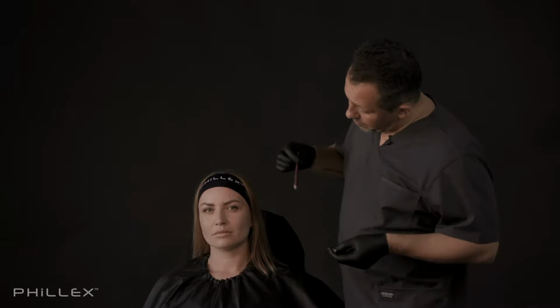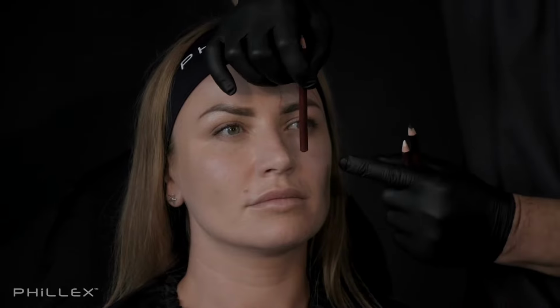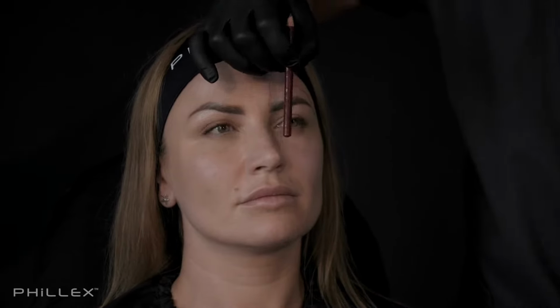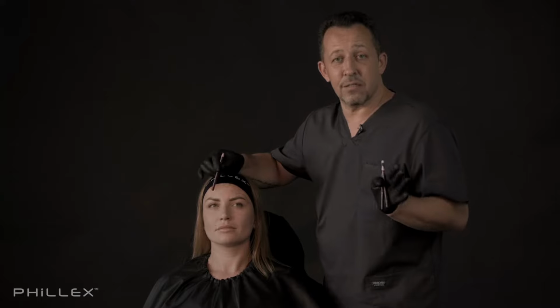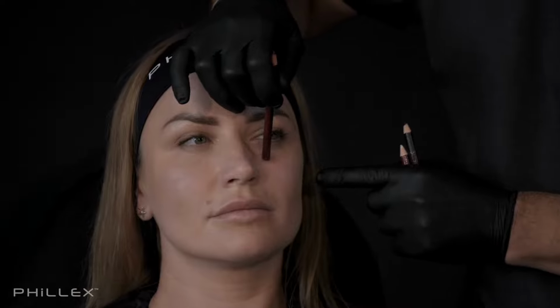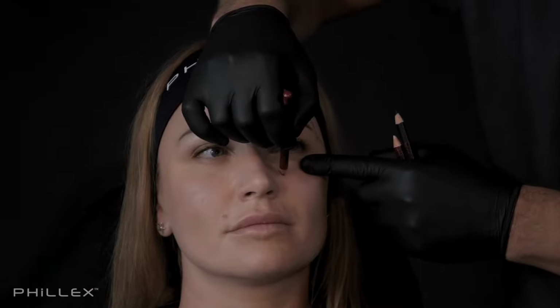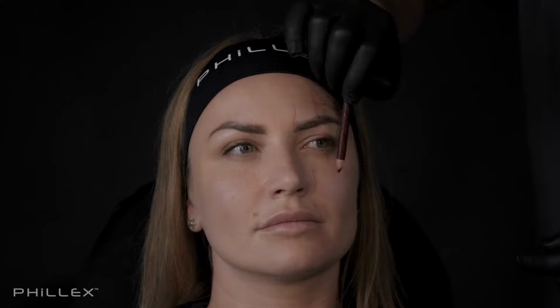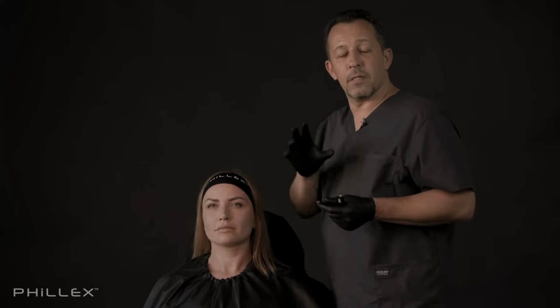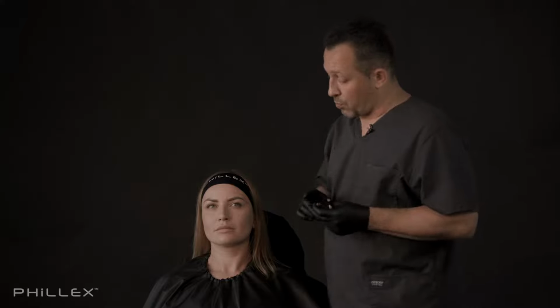Going down, we have arteria infraorbitalis. We can check the place where it starts, because it starts together with the vein and nerve infraorbitalis. We can press, and our model tells us, yes, this is the place where I feel the light pain, and we know that this is the place where it starts and goes. Injecting in the middle part of the mid face, the more medial part, we have just to go a little bit lateral, and the injections become much safer.